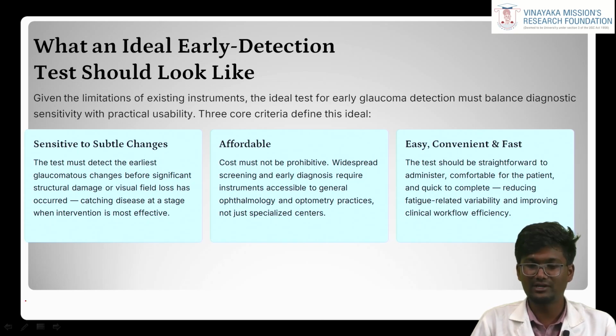The test should be straightforward to administer and comfortable for the patient, because with instruments such as SAP, static automated perimetry, the test duration is quite long. It should be comfortable for the patient and quick to complete, reducing fatigue-related variability and improving clinical workflow efficiency.